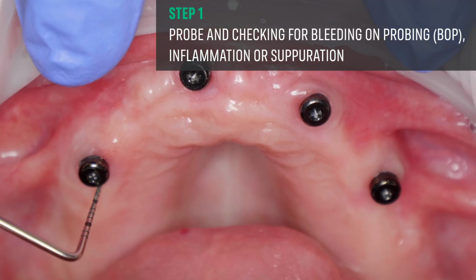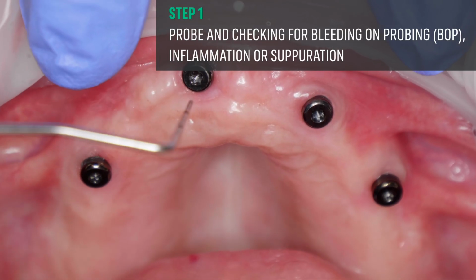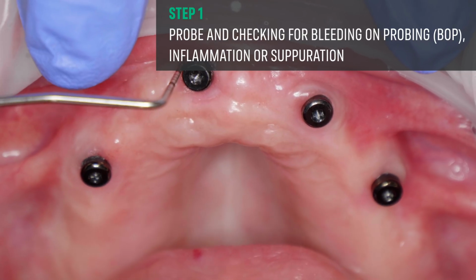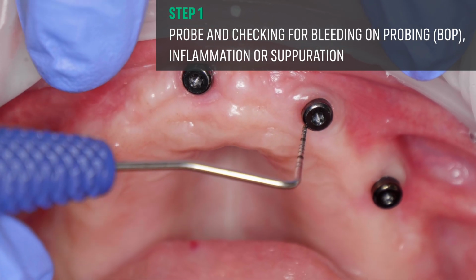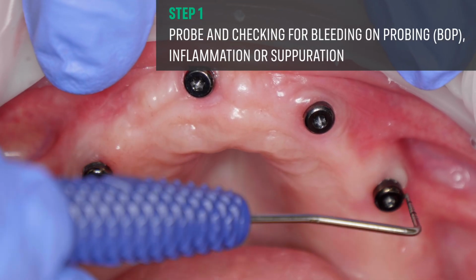So I'm just going to check for any signs of bleeding, inflammation, pocketing. You can see there's no signs of redness or swelling or suppuration. It all looks healthy.